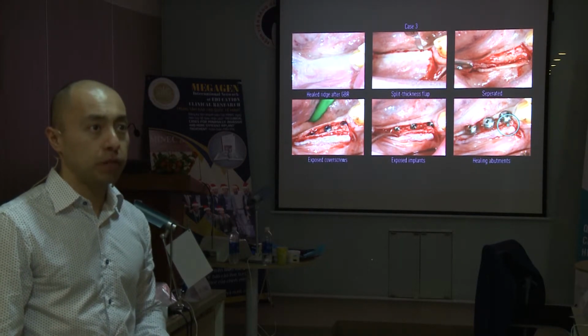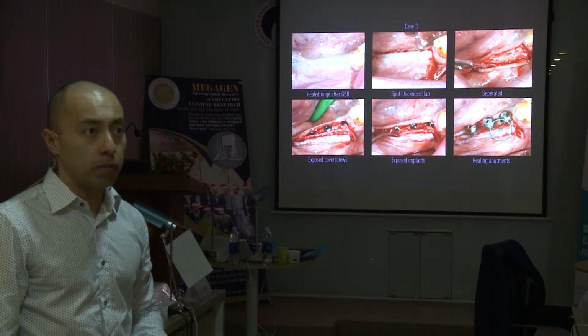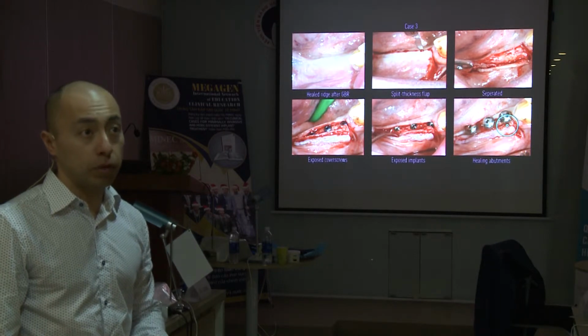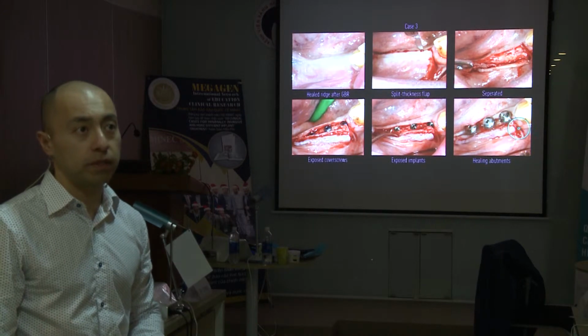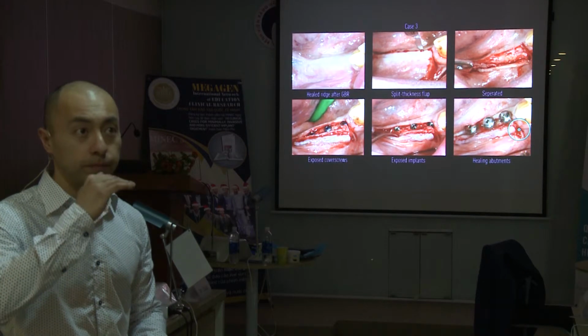So now I suture the periosteum back to each other. But if I move this soft tissue more up here, I will lose it again. So what I do is I try to suture this part till here, so it does not move coronally.